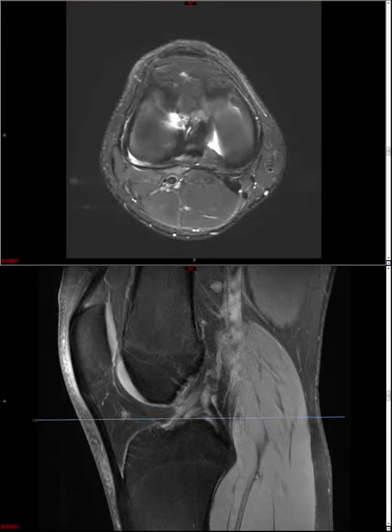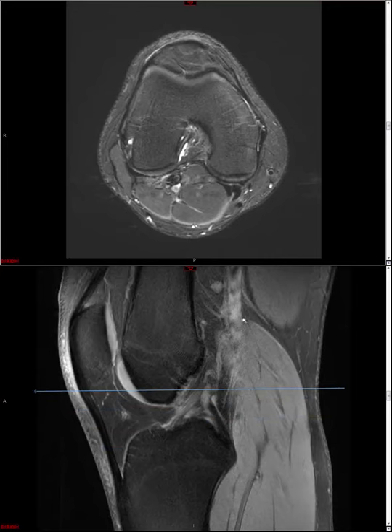Okay, so let's start with the ACL. I think it's trickier, and I think one of the common questions early on is what plane should I use to look at the ACL? And I think the most honest answer is it's all of the above. And we're going to go over each sequence and what I look for on each of the planes to get a comprehensive look at this ACL.